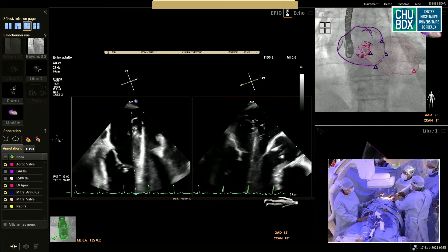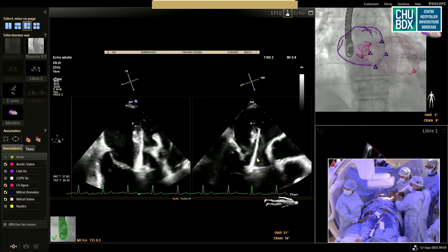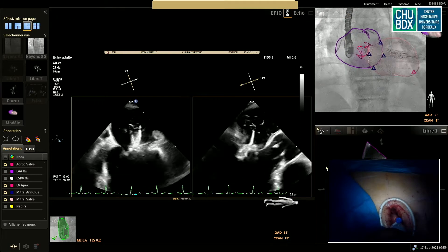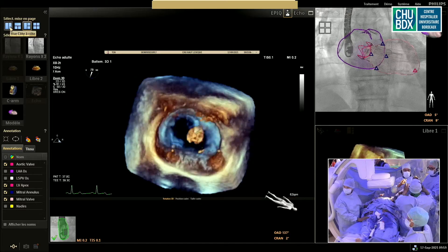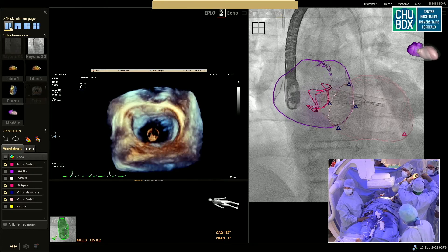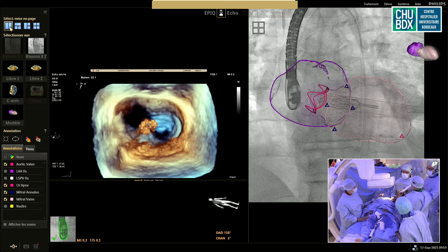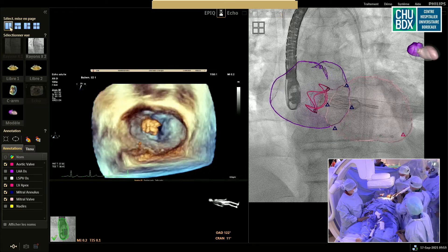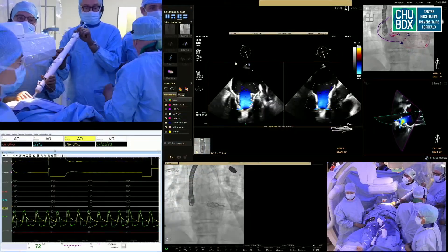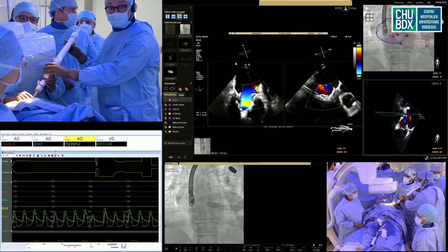You can see the valve started appearing now on the fluoro. I have made some notation on the skin of the patient, because the movements you do with your hands on the catheter go opposite on the echo. Now, step number two — there's a knob number two. We're going to pull on the metallic wire because it can get some redundancy during the first phase. This is what Lionel is doing. We close it again, and now we move to number three, which is the final step of the implant. We're going to check PVL, because we can still fine-tune and adjust it. PVL is no issue.